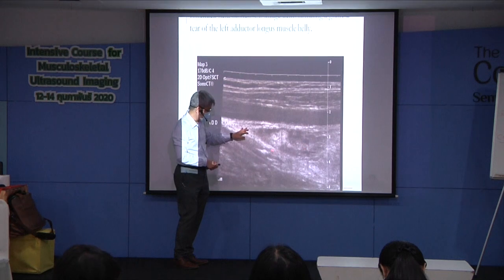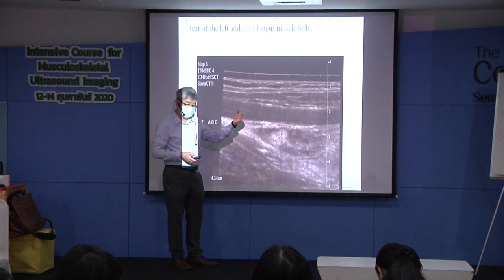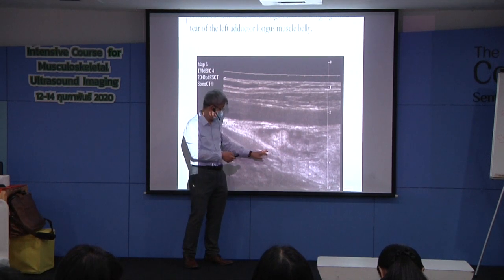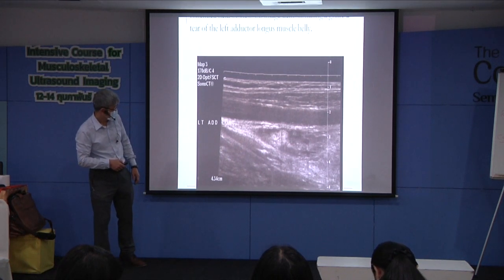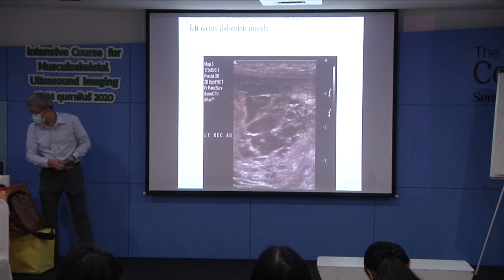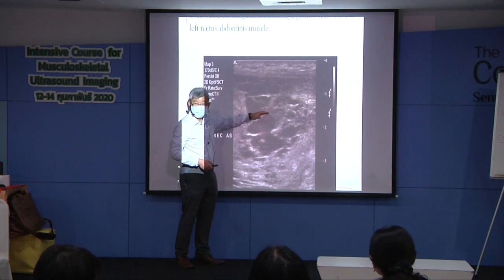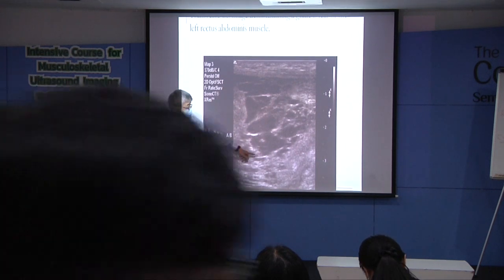If there is a rupture, you ask the patient to do some muscle contractions. You may see the gap appear in the rupture site. And this is another example. We cannot see the detail of the muscle. The detail of muscle is almost gone.